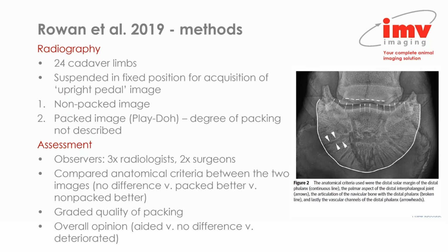They also graded the quality of packing based upon the radiographs and provided an overall opinion on whether they thought packing aided versus deteriorated image quality, or whether it made no difference.